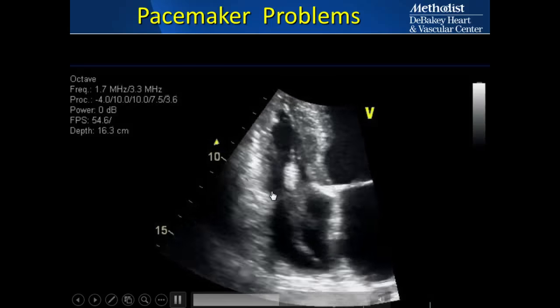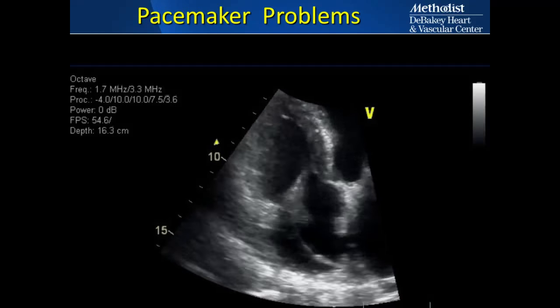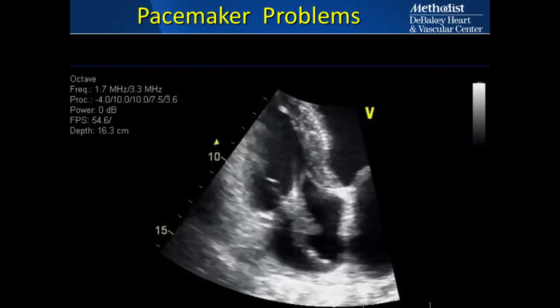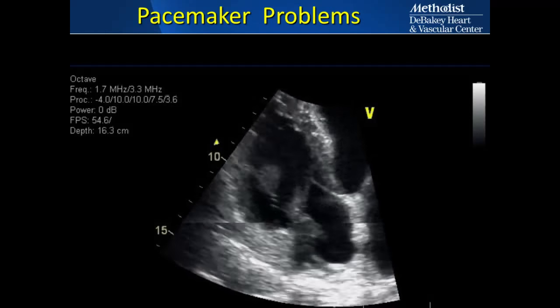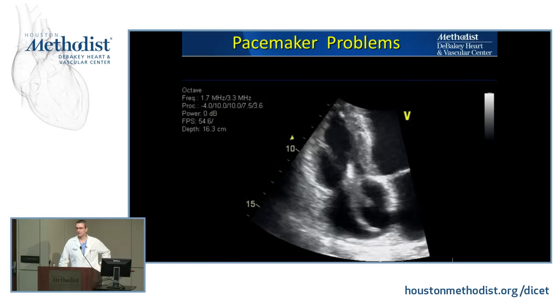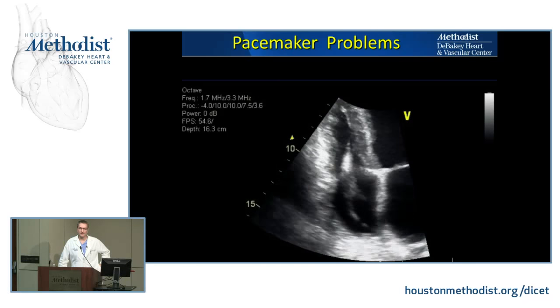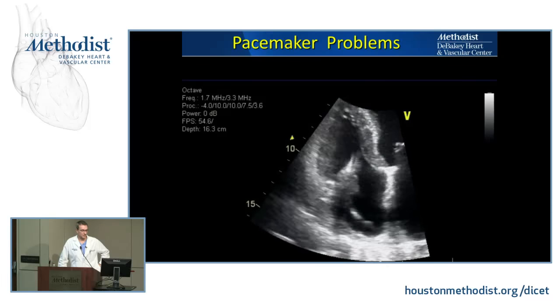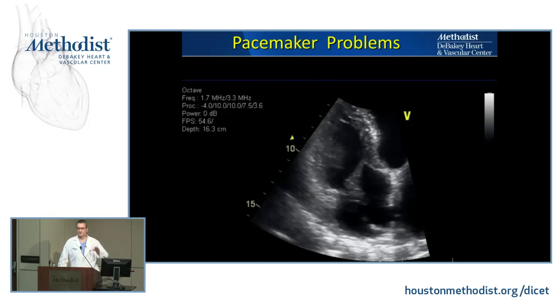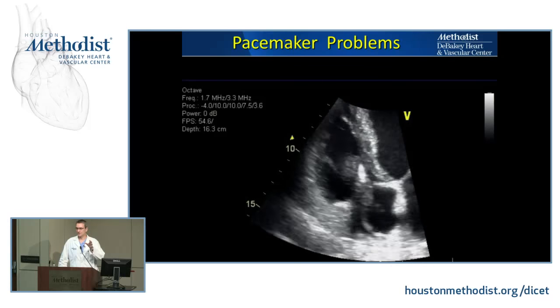We often get asked by clinicians, is it a vegetation? Is it a thrombus? What is it? And there are times you just don't know. And it's important that you don't pretend to know. You can sort of try to put the clinical scenario together. Is there a low flow? Makes thrombus more likely. Is there atrial arrhythmia, like AFib? Makes thrombus more likely. But at the end of the day, you can be wrong. So thrombus and vegetation, there is no specific echocardiographic or histologic feature that tells you the difference. It really is putting together, what's the company that this mass keeps? Stasis, think thrombus.